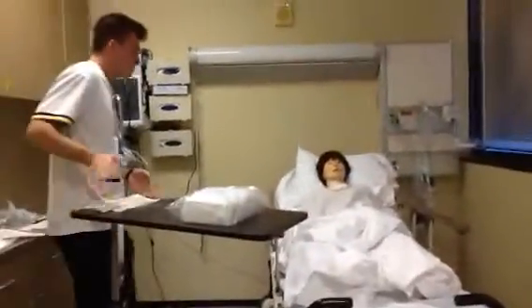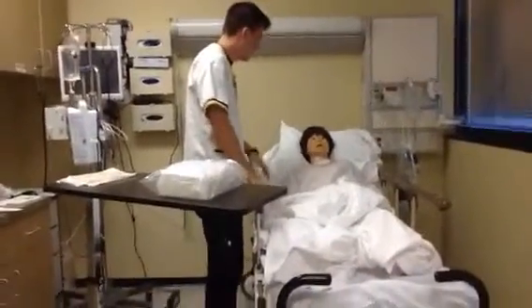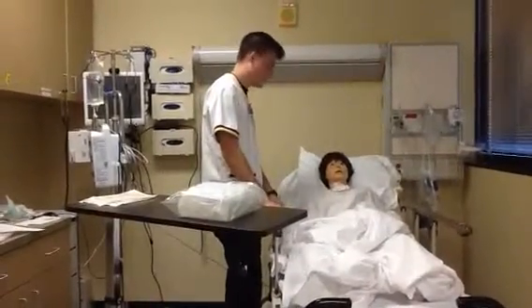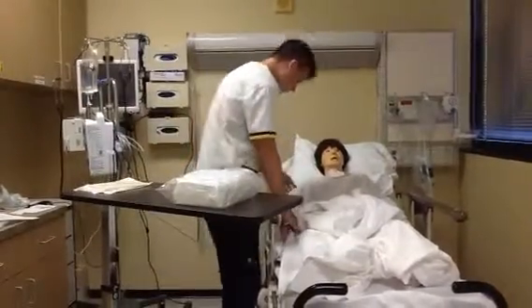Mrs. Knight. I have orders to put in a foley catheter for you. I understand that you haven't been able to go to the bathroom. You haven't been able to urinate in quite a while. Okay. Can you please verify your name and date of birth for me, please?